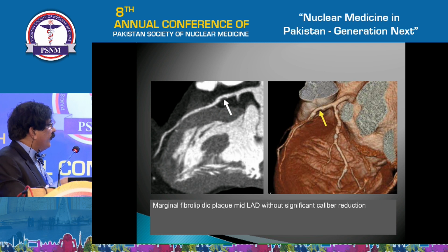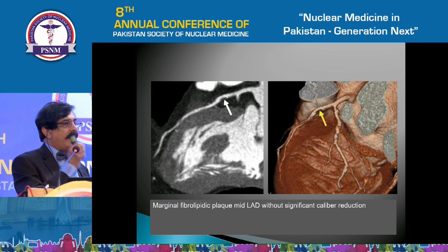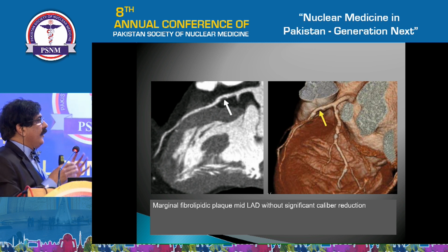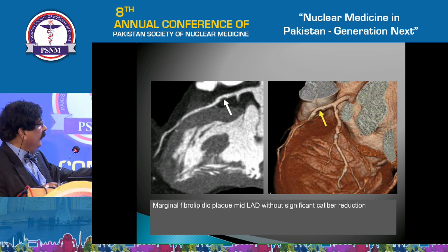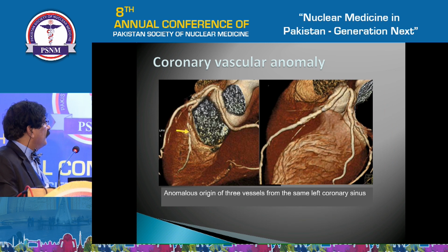So we also have auto-regulation when there is plaque narrowing a coronary artery, then auto-regulation and other mechanisms come in to dilate the vessel at that time, and that cannot be detected by invasive angiography. However, here you can actually detect the plaque as well as the fact that there is no significant stenosis. So in that case it is better.